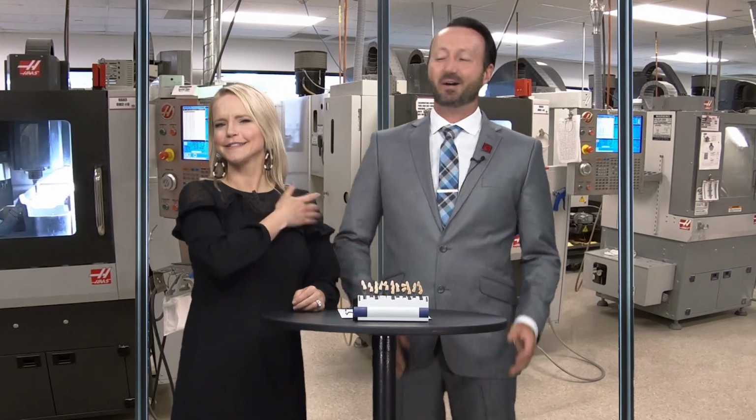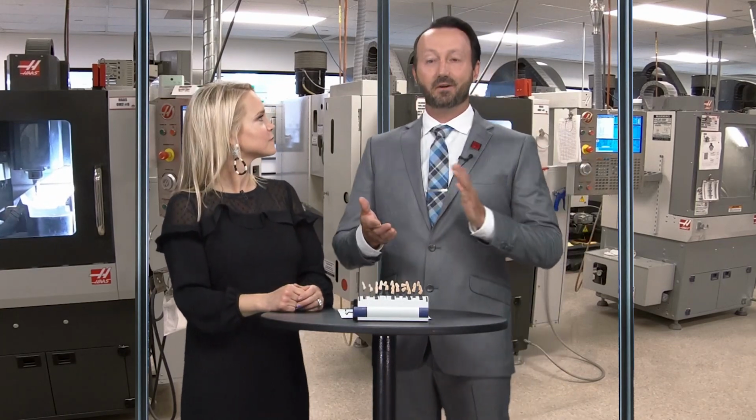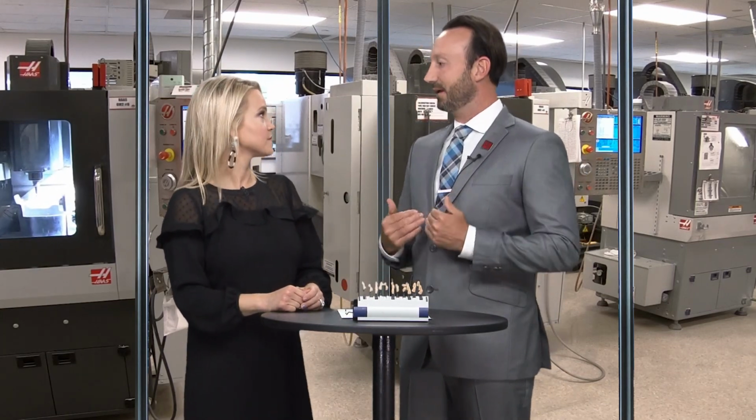Oh, goodness. Well, let's get real for a minute. I think shade taking is very important. The lab needs to know, and we need to communicate this between the doctor, the patient, and our dental laboratory.